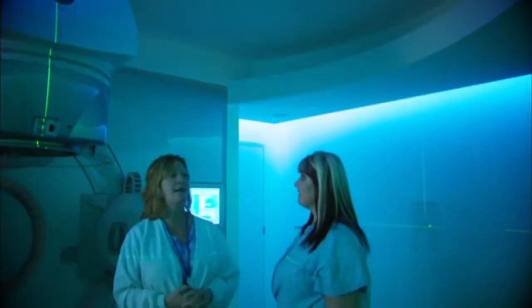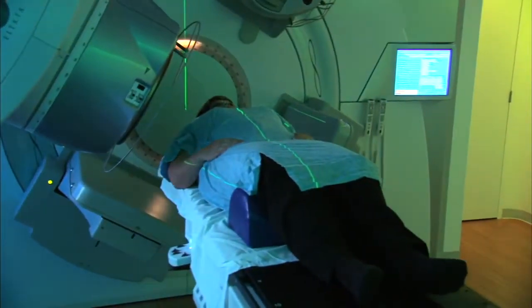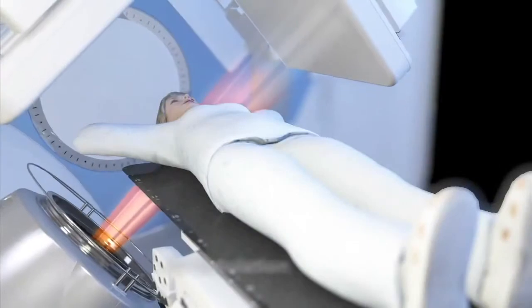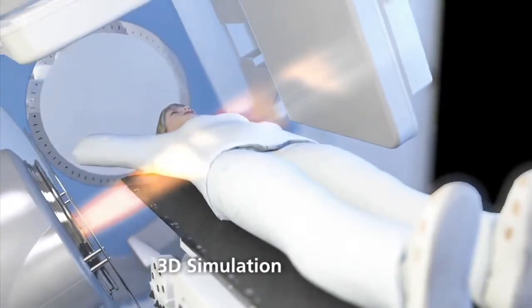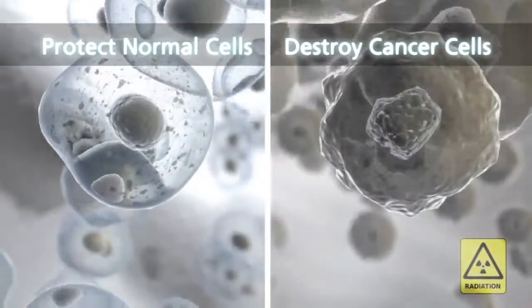Radiation therapy is one of the safest, most effective tools in cancer treatment today. It may be used to reduce the size of a tumor before surgery, or to destroy any remaining cancer cells after surgery. It may also be used as your primary treatment course, or in conjunction with chemotherapy.